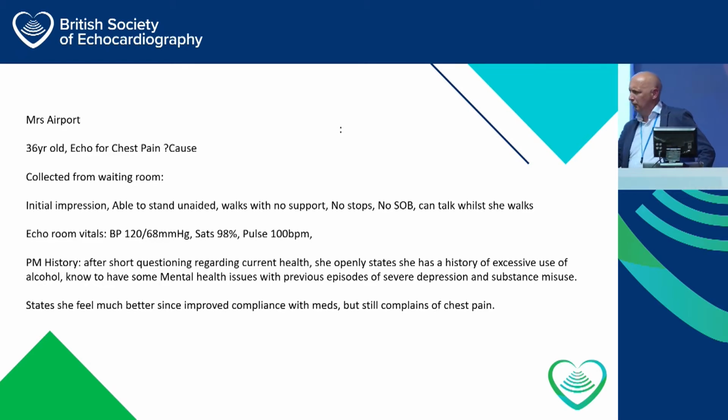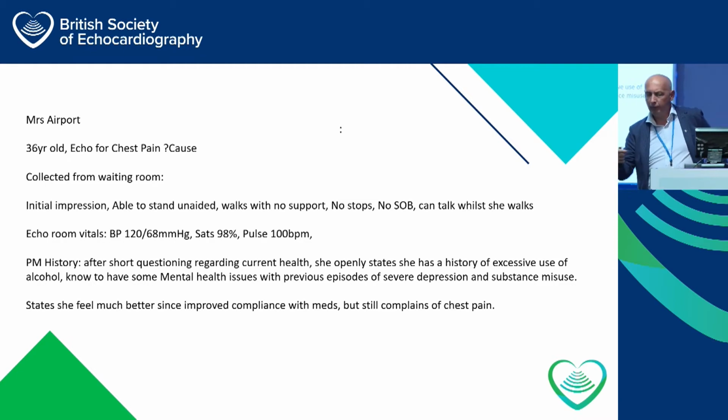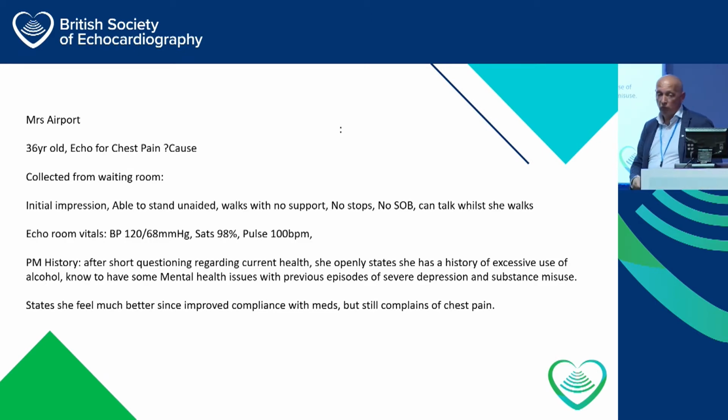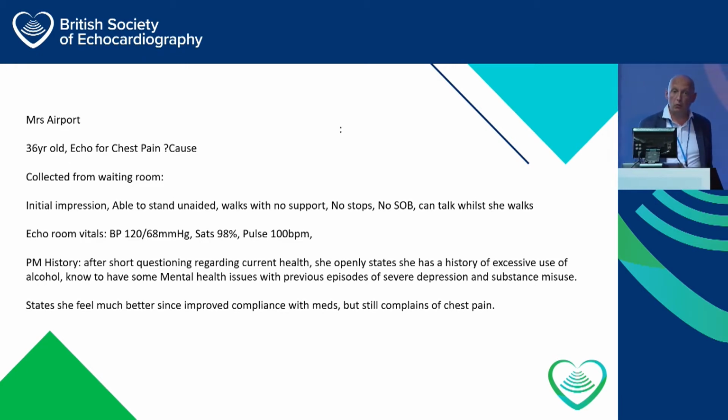That thing that we're meant to be triaging out that we don't do anymore. But she's come again for chest pain. So I go around and I collect her from the waiting room. And the initial impression I get from her is she's able to get up. She's unaided. She walks with no support. She can walk all the way to the echo room without stopping. She's got no breathlessness. She can talk when she walks.